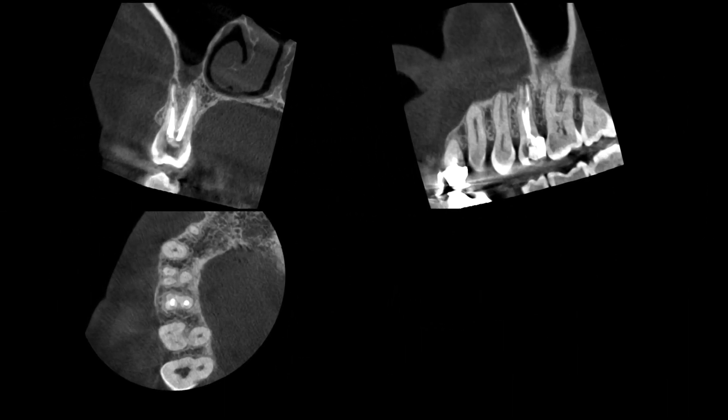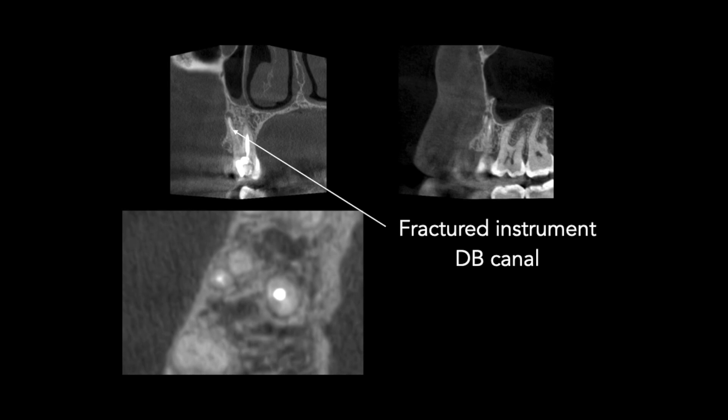In this case a small volume CBCT scan was exposed, and it clearly showed that the tooth had three root canals and there appeared to be a foreign object at the apex of the distobuccal root. Here is another slice from the same CBCT and you can see the fractured instrument in the distobuccal canal and an uninstrumented MB canal.